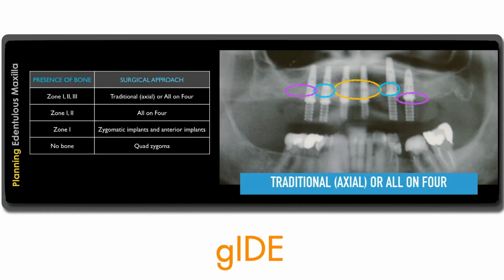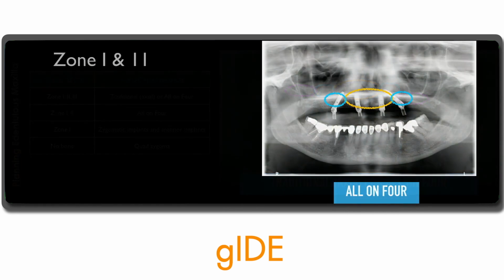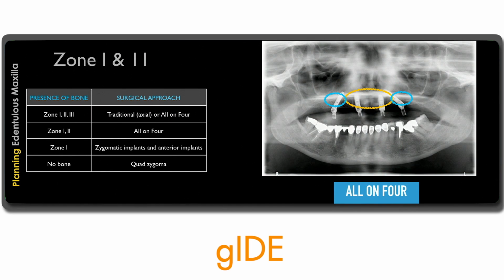So the traditional approach, axial implants, you might place 6 implants. We have bone in all 3 zones. You could even use 8 implants if you wanted to and have a segmented prosthesis. If you have a case where there's only bone in zone 1 and 2, it's an all-on-4 type treatment.